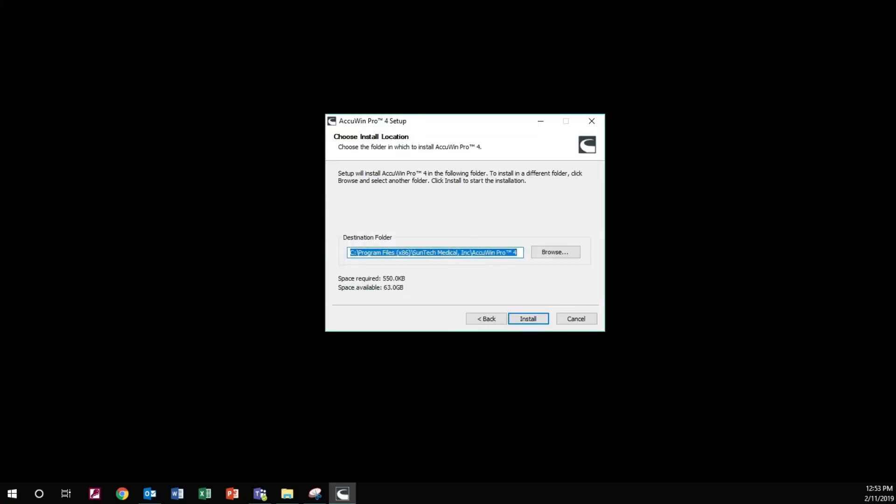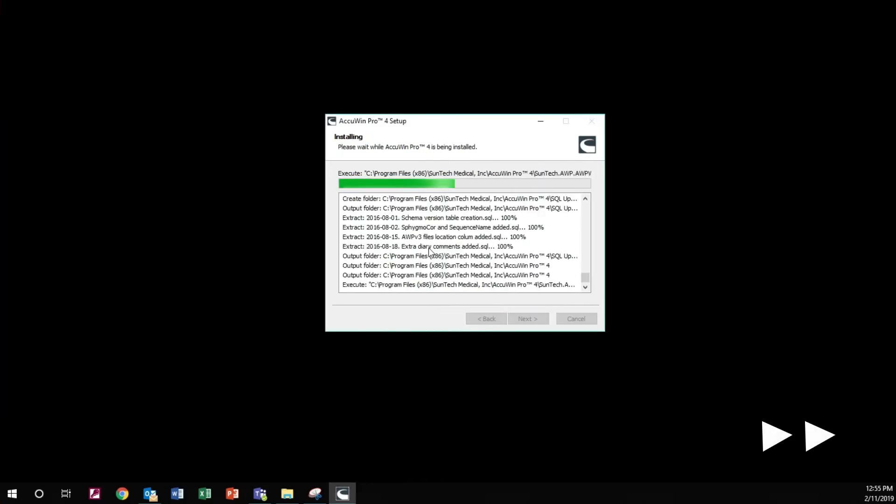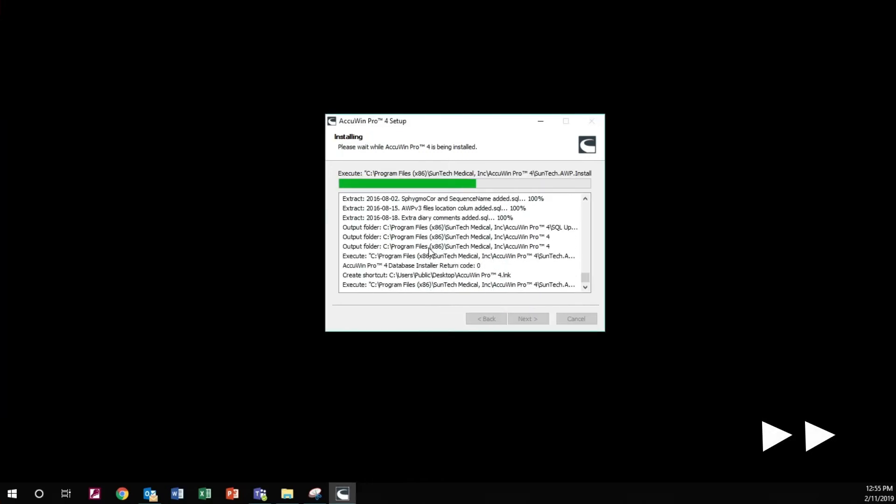Select the location for the software to be installed on the workstation. Allow a few minutes for AccuWin Pro to install.